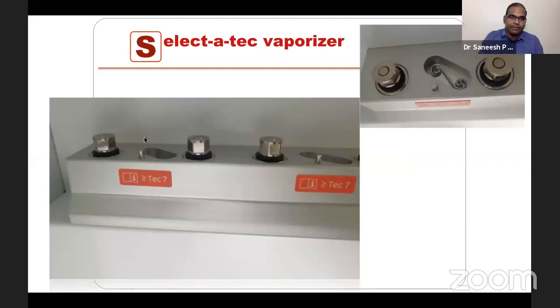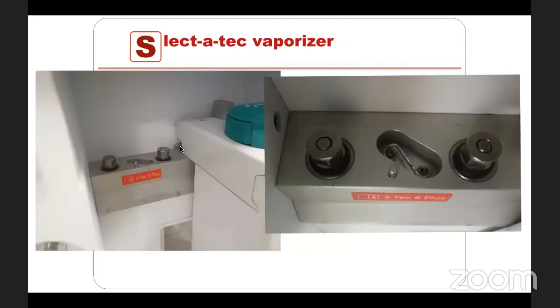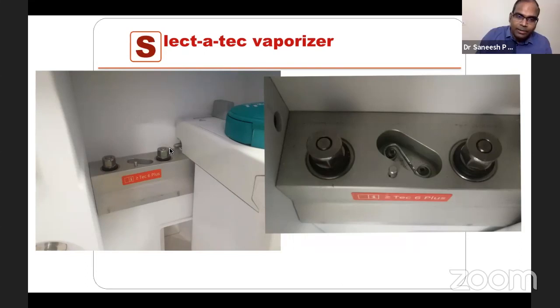So this is the inlet to the vaporizer. The vaporizer output comes and joins the manifold through this. This one is for vaporizer 2. Clear? So this is the in, this is the out from the vaporizer. Again, you can see the vaporizer mounted. You can see the extension rod. When this is open, this extension rod gets pushed laterally so that the vaporizer here cannot be opened.